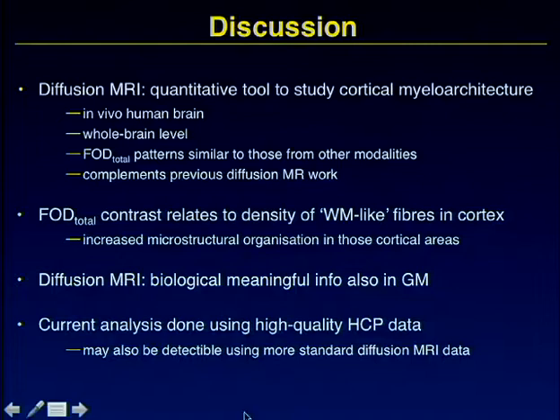What is more doubtful is, in the scanners that we have, or the scanners here at the hospital across the road, are you going to be able to see it with N = 1? That may need a lot of optimization of protocol and maybe a bit longer acquisitions. At the moment, this is what we are trying to determine.